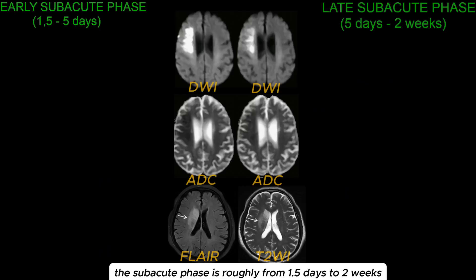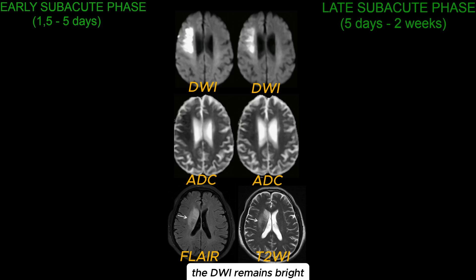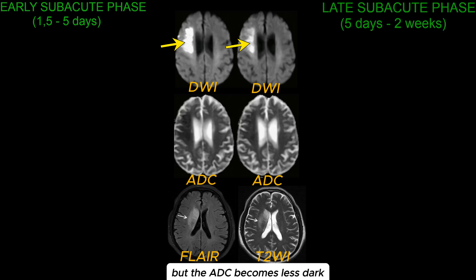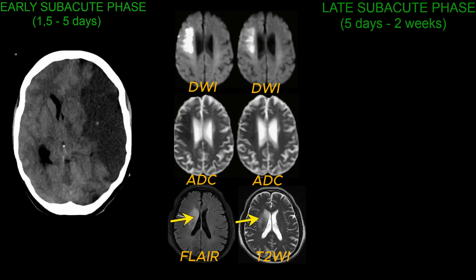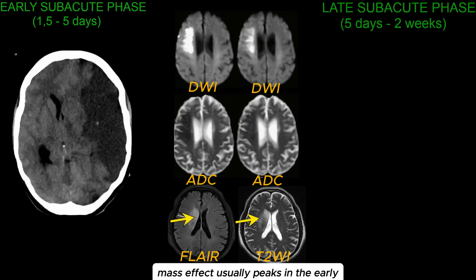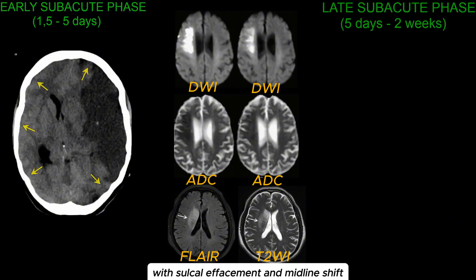The subacute phase is roughly from 1.5 days to 2 weeks, and we can divide this into the early and late subacute phases. The DWI remains bright, and this is typically due to T2 shine-through, but the ADC becomes less dark. The FLAIR and T2 changes are still bright. Mass effect usually peaks in the early subacute phase, with sulcal effacement and a midline shift, as demonstrated here.